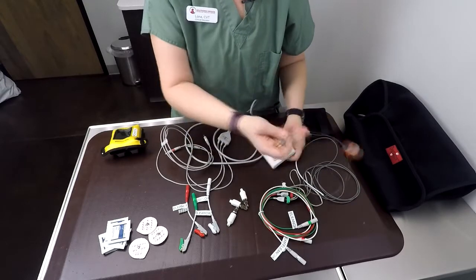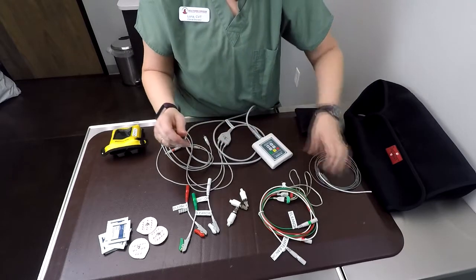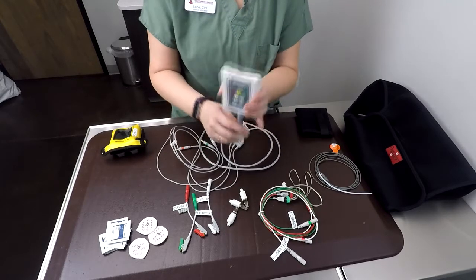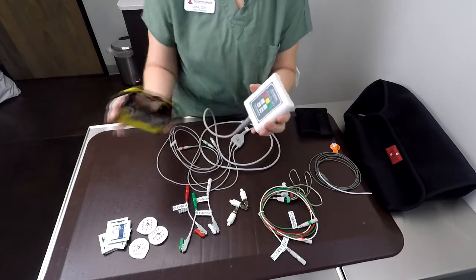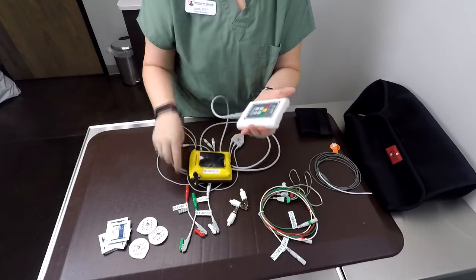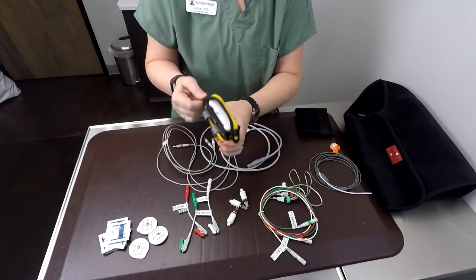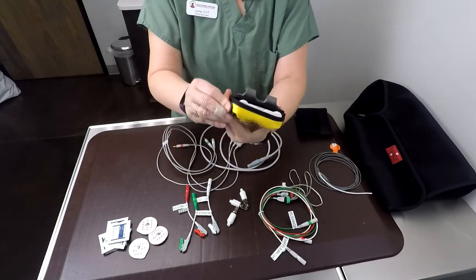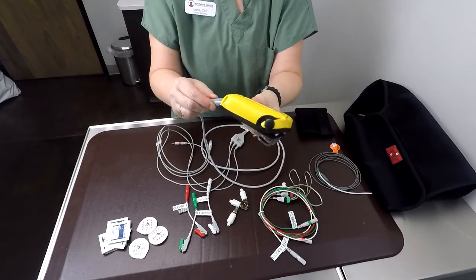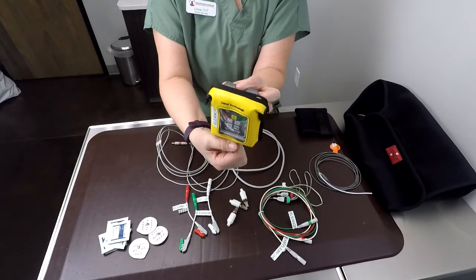There is also a velcro strap that comes with the temperature probe so you can attach it to the patient's tail if need be. For patients that are too small to attach this unit to them, we have cage front kits. You unhook the cable, it slides into the case and snaps down, and there are hooks on the back to hang on the cage door with a port where your cable attaches. That would be your cage door unit for small patients — cats, little puppies, kittens.